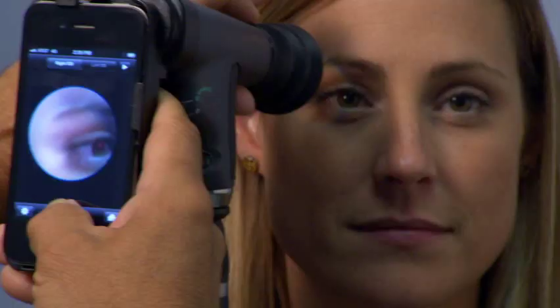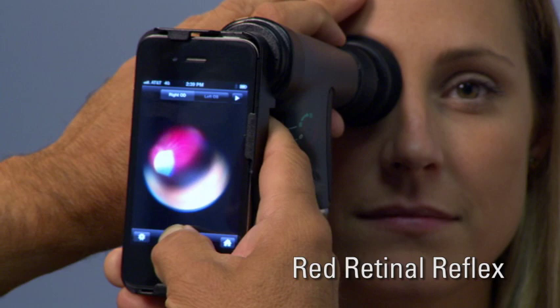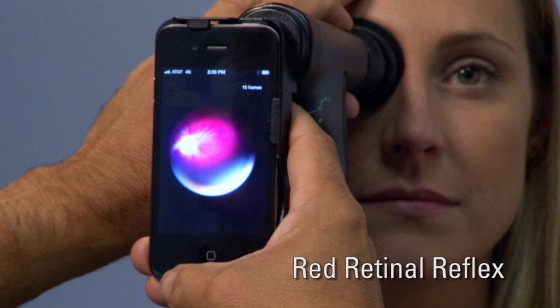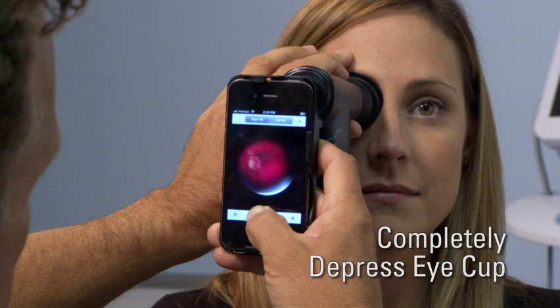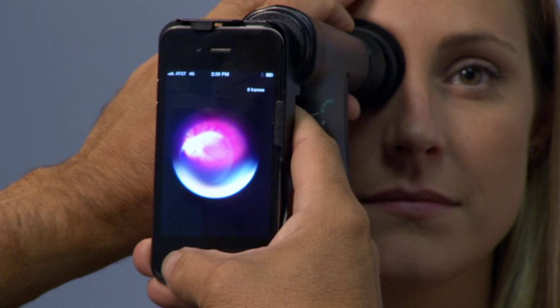Find the patient's red retinal reflex on the screen. Once you see the red reflex, move slowly closer to the patient, keeping the reflex in the very center of the screen. If you find it hard to stay steady, you can rest your fingers on the patient's forehead. To achieve the maximum view, you'll need to completely depress the eye cup over the patient's eye. Once the desired view is achieved, release your thumb from the camera button to capture multiple images of the fundus.